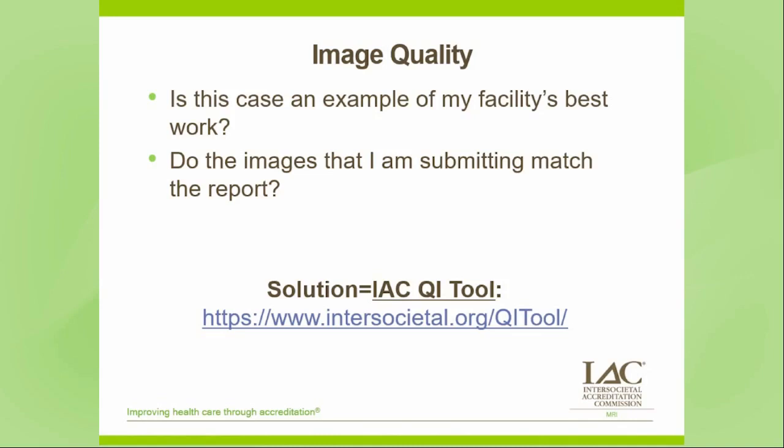You'd be surprised how often people skip this step and submit a case study with poor image quality. In some cases, we've even seen exams submitted that the facility's interpreting physician think are poor quality, as they'll reference the patient motion and any other artifacts as limitations in the report.